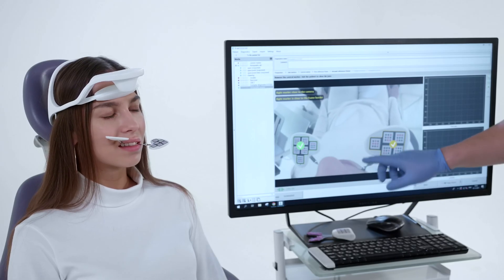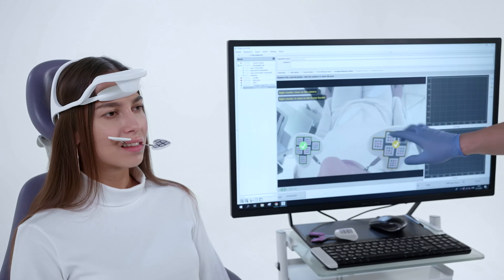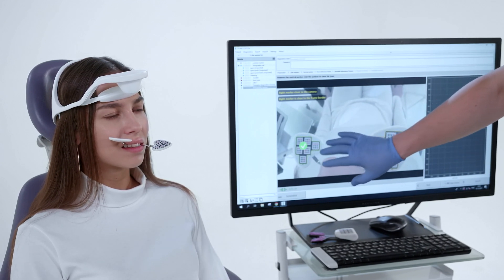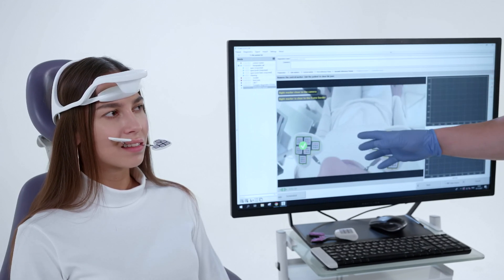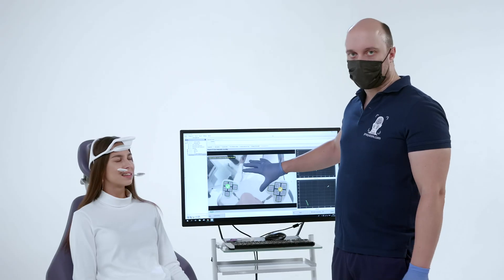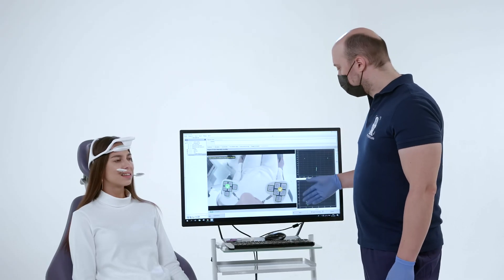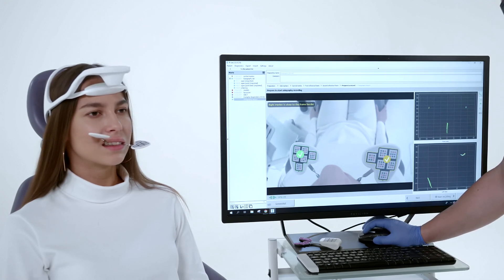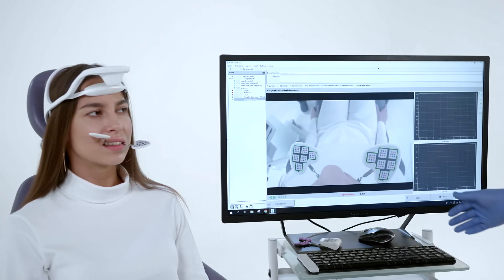Second stage. Fix the position of the side markers. At this stage, the patient's jaws must be articulated in the usual occlusion. The camera can then record trajectories. Axiography starts after pressing the start recording button.